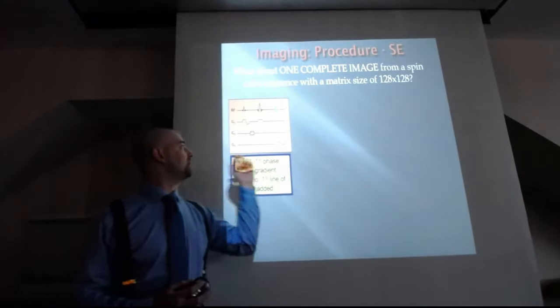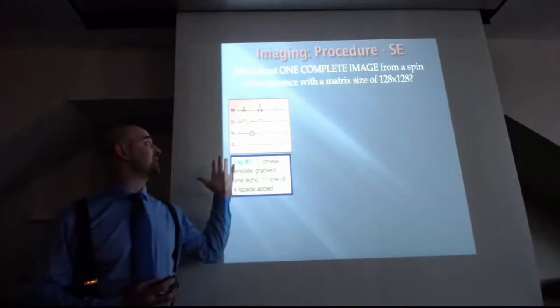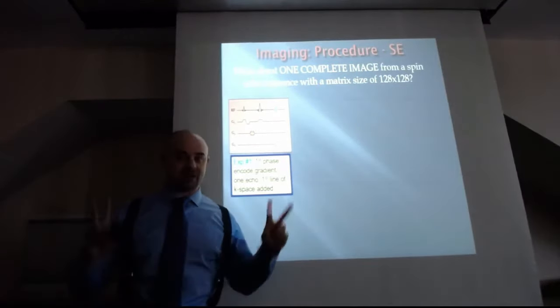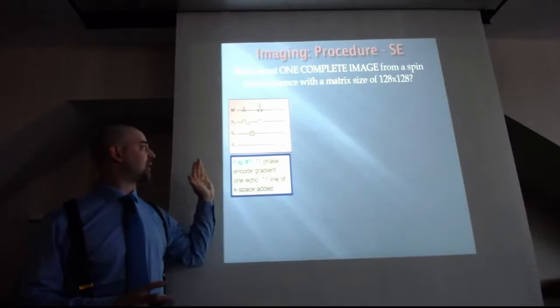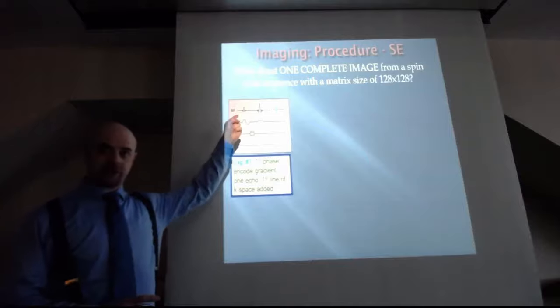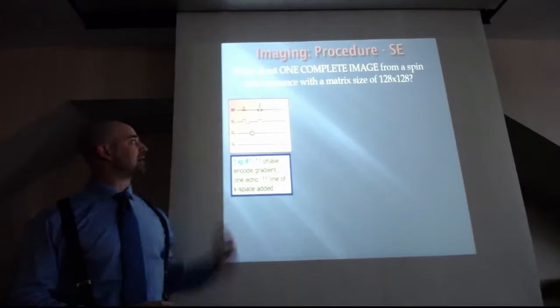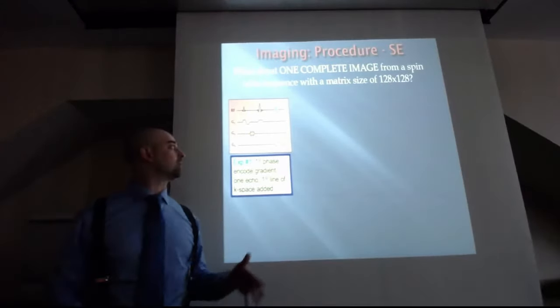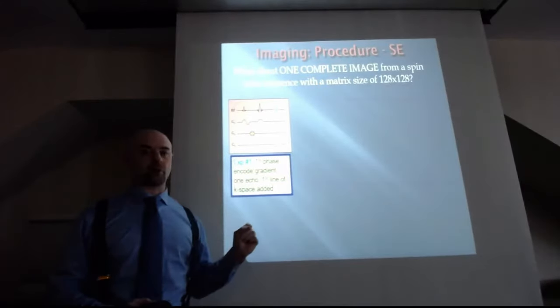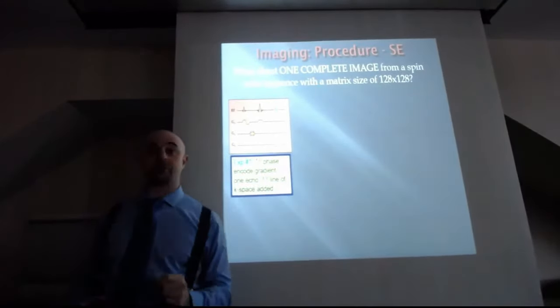Okay, so we do all the steps in the pulse sequence diagram. Each pulse sequence diagram is going to represent an MR experiment. So let's call this experiment number 1, right? In experiment number 1, we use the RF pulse to generate the magnetization in the XY plane. We apply the first phase encode gradient. I've made it a little bit yellow near the center.